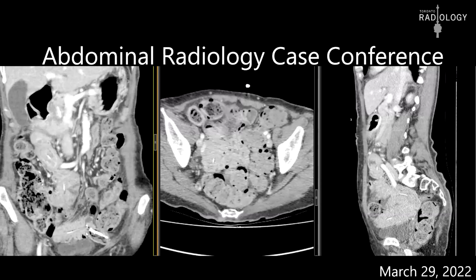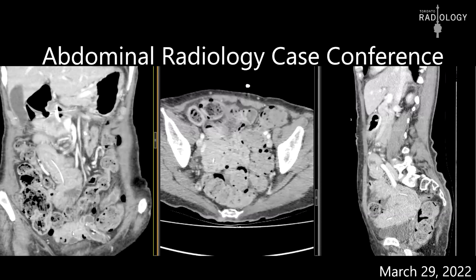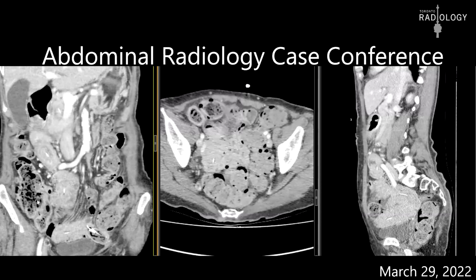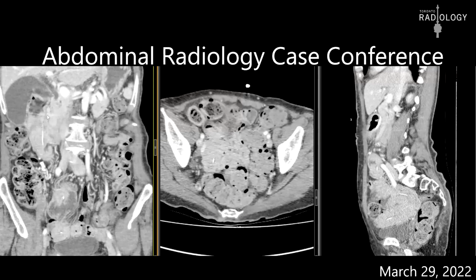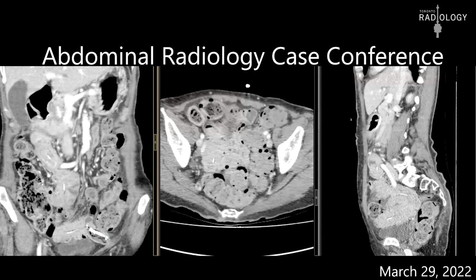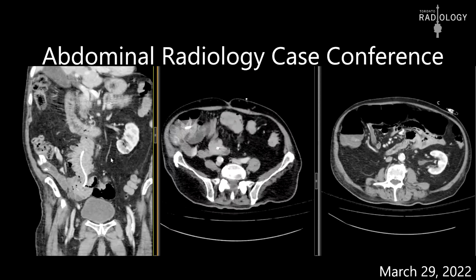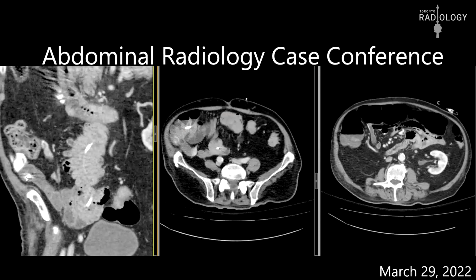So basically, the bezoar formation forms a lead point over which the intestinal loops are telescoping behind it. All the bowel loops are scrunched up behind it, and that causes distal migration of the tip. And because the tube is now stretched, this causes all these chronic pressure ulcers. And that's exactly the same diagnosis in both cases, in which the phytobezoar forms the lead point for distal migration. And even here, we can actually find this mottled phytobezoar.